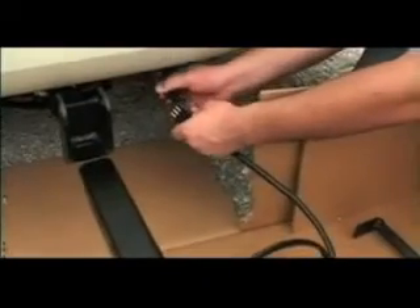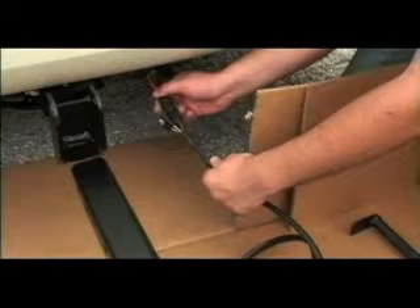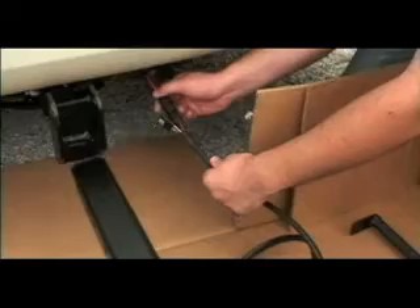Connect the power cord from the lift to the vehicle wiring harness. The lift is equipped with a second connector that is used to power the integrated license plate light. Attach it to the towing package connector that was installed as part of the hitch installation. If the towing package connector was not installed, it will be necessary to run a separate wire directly from the vehicle's license plate lights to the lift using a quick disconnect.